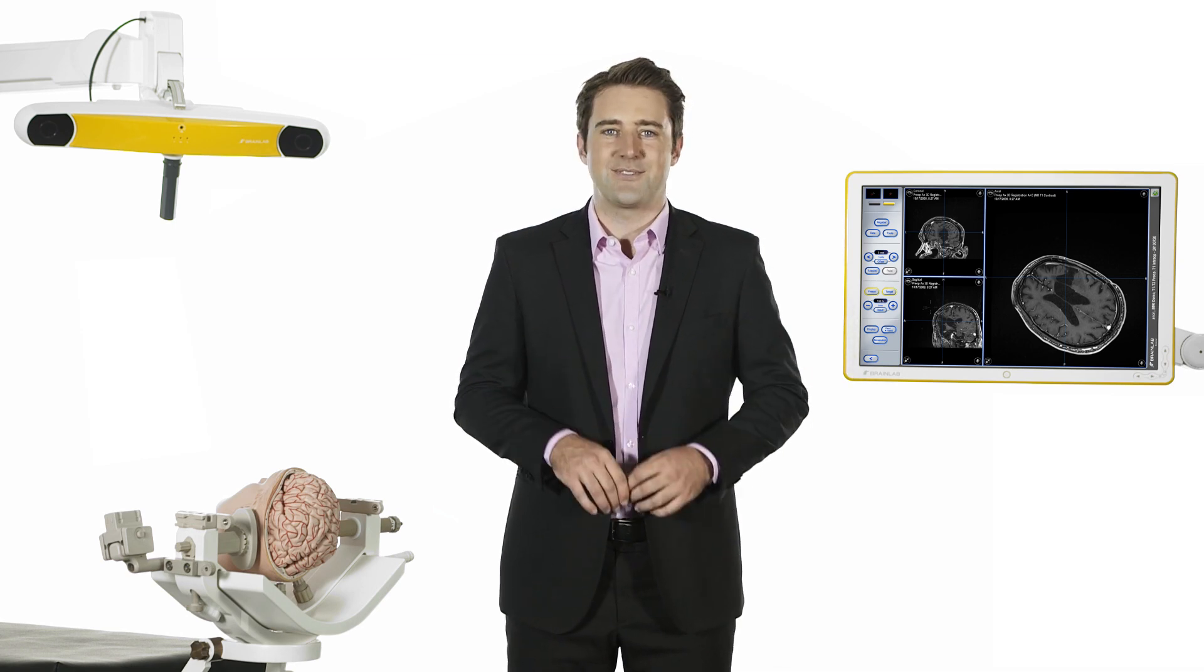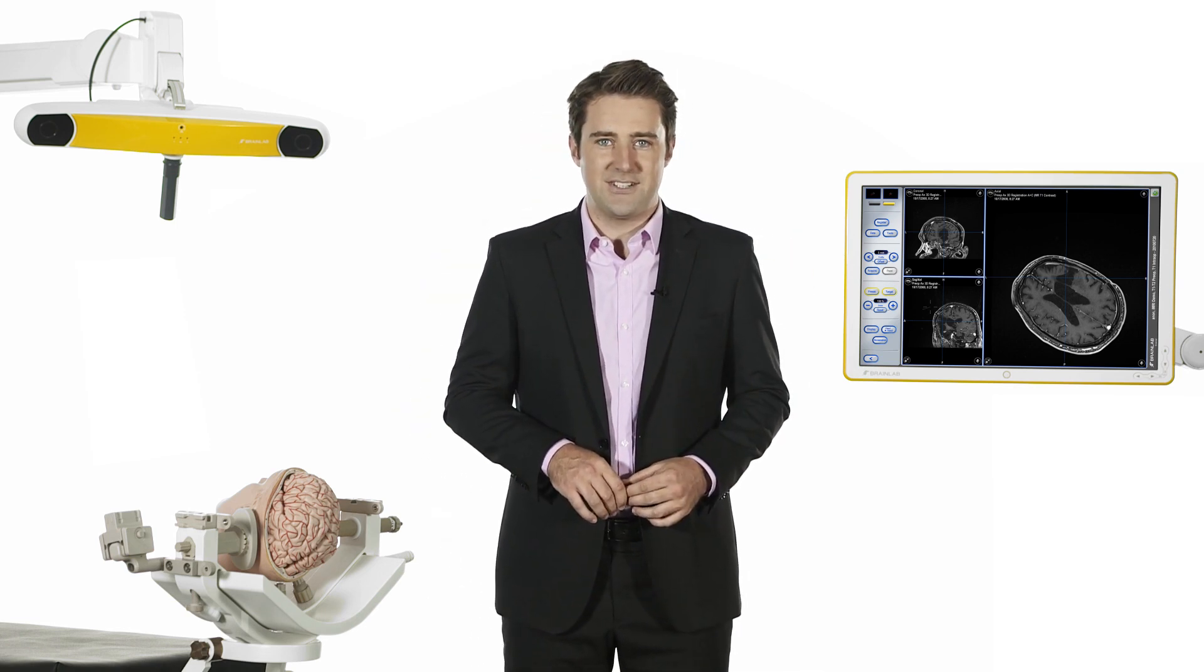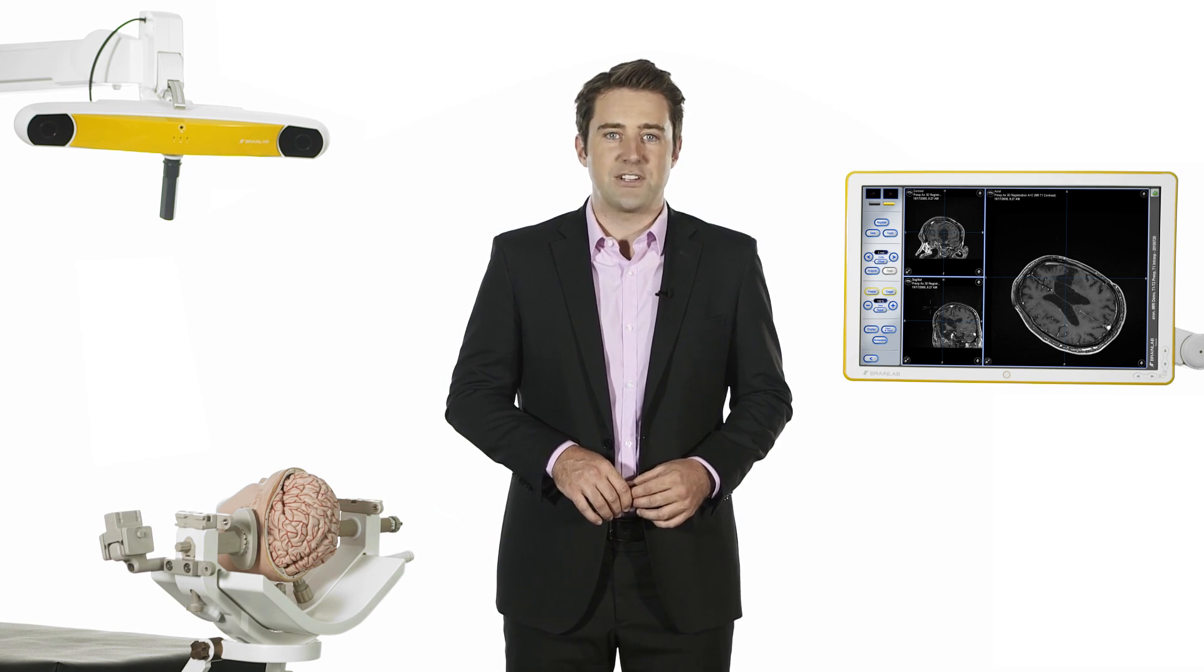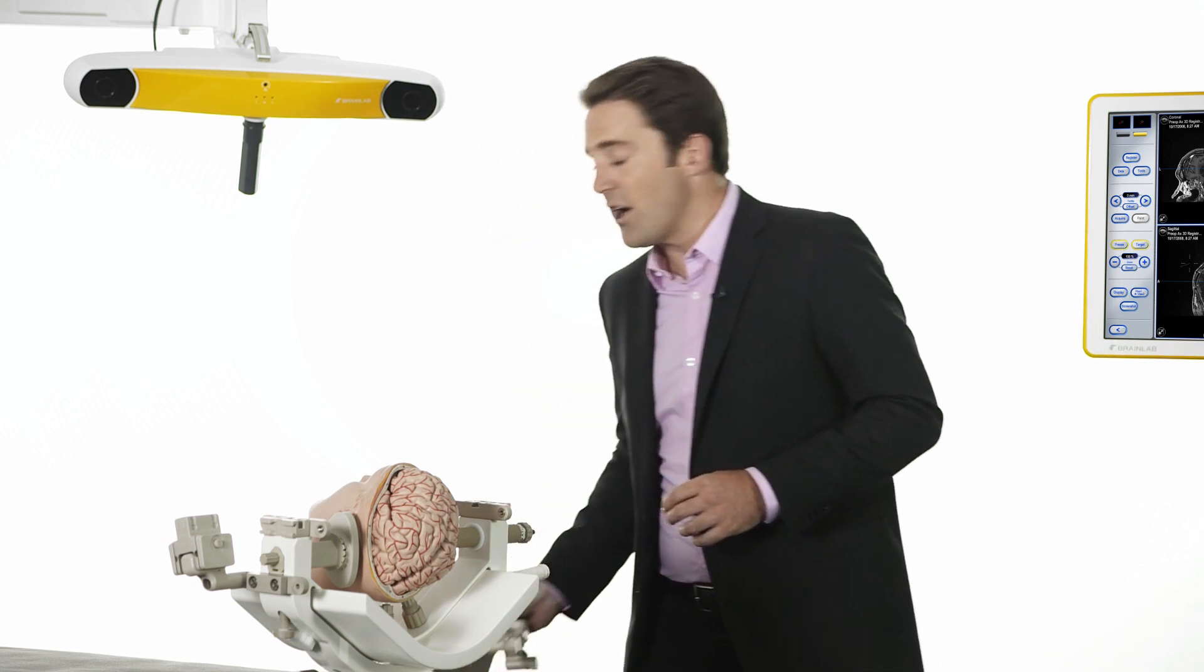Automatic image registration makes navigation more precise by providing up-to-date patient images in minimal time with high registration accuracy. AIR software works in combination with dedicated AIR hardware.